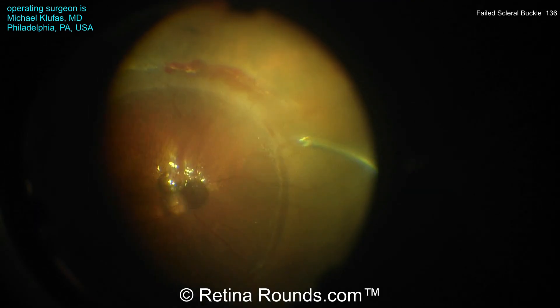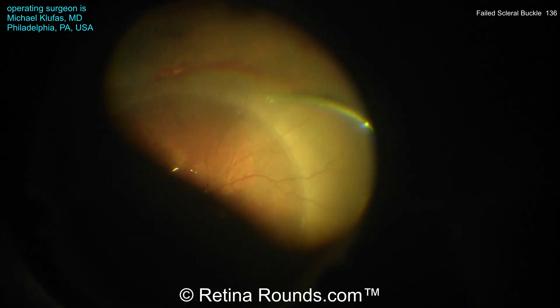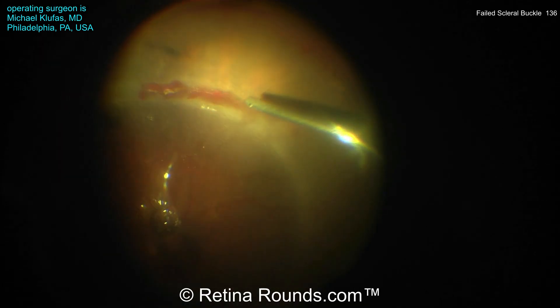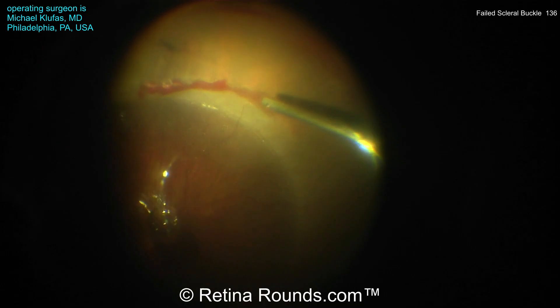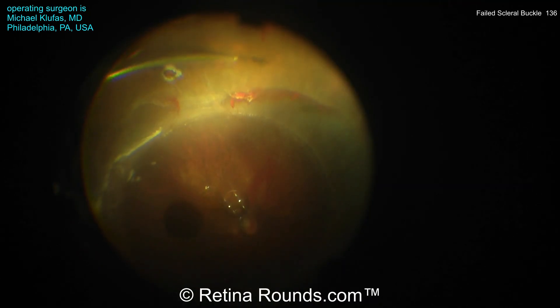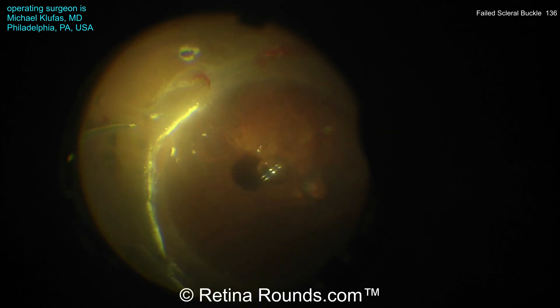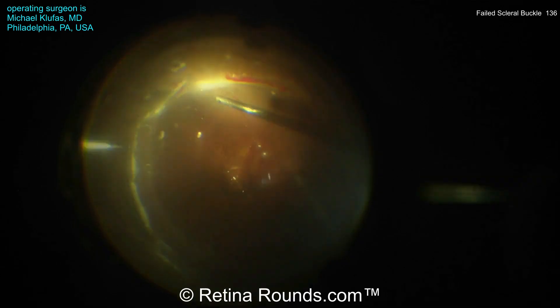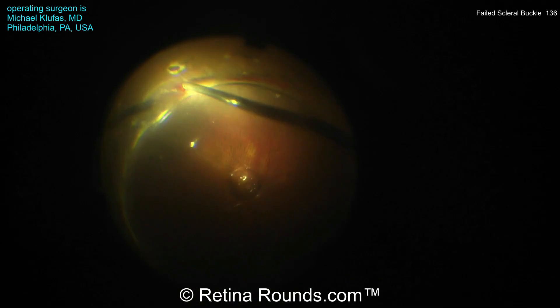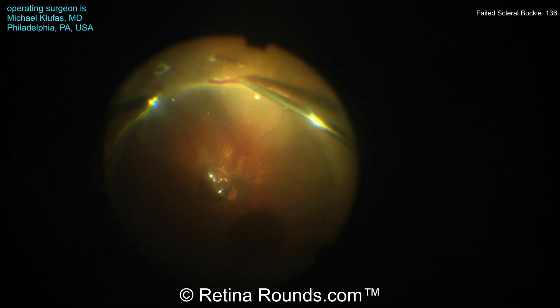In this part here, you can see that he's lifted up the hyaloid, which is trapped under this perfluorocarbon liquid bubble. And now he's able to more thoroughly trim back the vitreous in the nasal quadrant. Now he's using some diathermy to mark the retinal break, to mark some areas of lattice degeneration as well, and a couple of other small atrophic holes that are here. And continuing to shave very meticulously, trimming back the vitreous just to relieve as much vitreoretinal traction as possible.